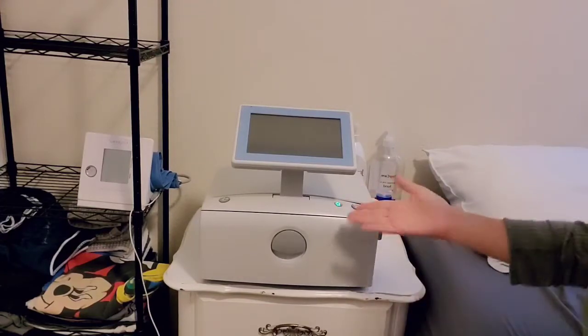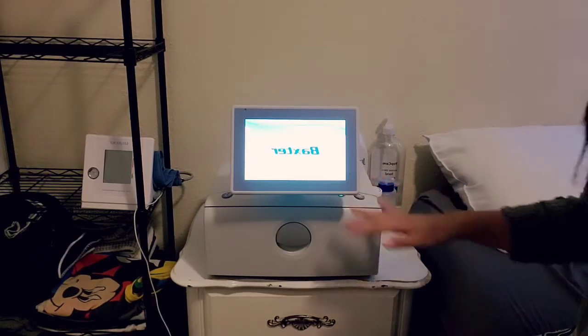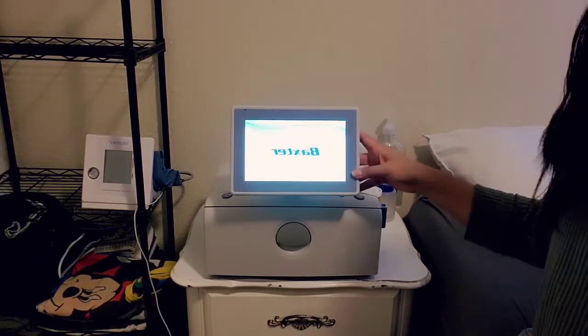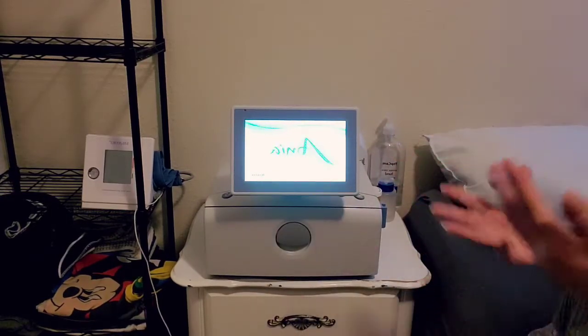Let's begin. I'm going to press the on button — it lights up nicely. It does take a while to actually turn on, so you can turn it on, walk away, do something quick, and come back. It's going to make a really loud noise once it's loaded and ready to test the machine.